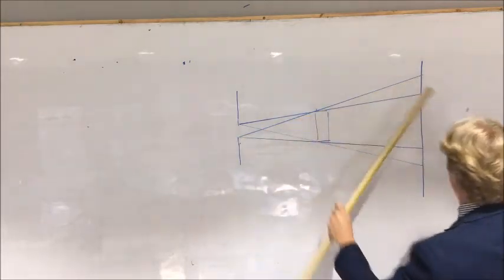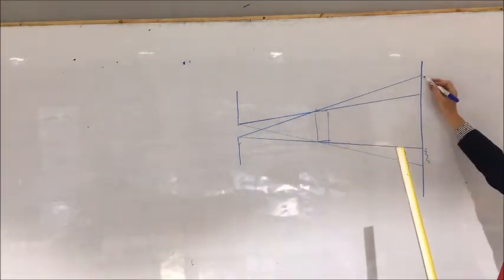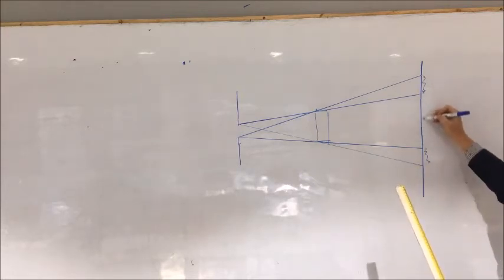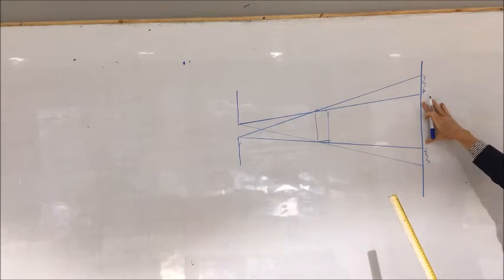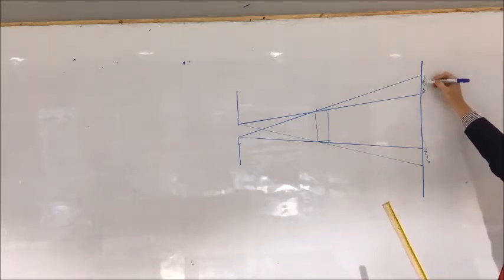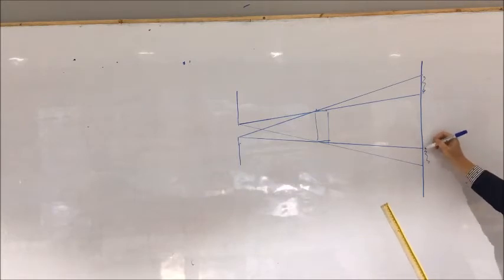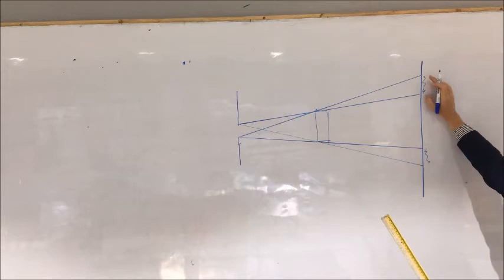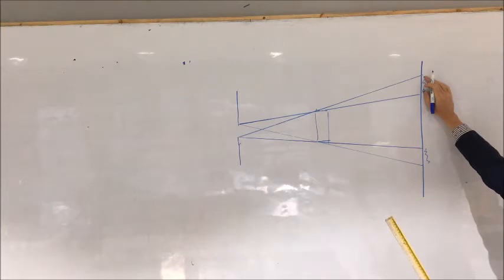So what this area here is, it's known as a penumbra, okay? This area here, if this were light and a shadow we were talking about, this would be very dark because it's completely covered. But this area is like the furry bits on the sides, okay? So if I want a sharp image, I want these furry bits to be as small as I can possibly get them. And there's a couple of ways that I can deal with that.